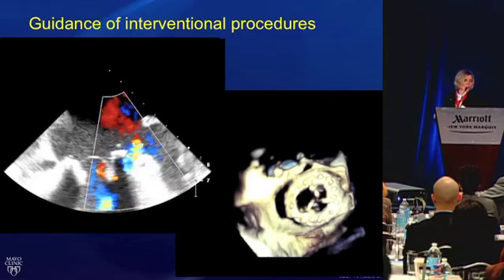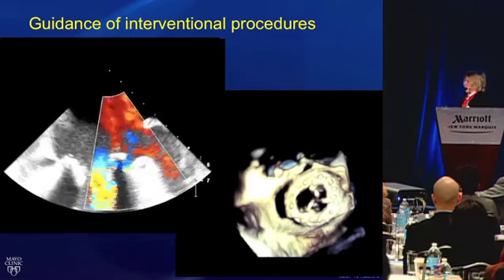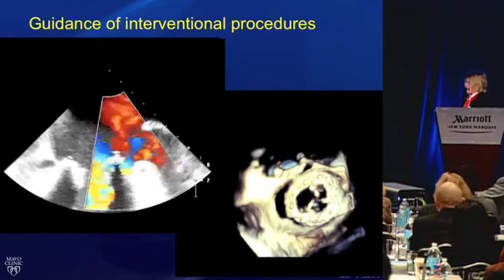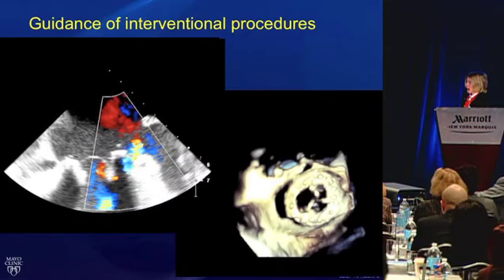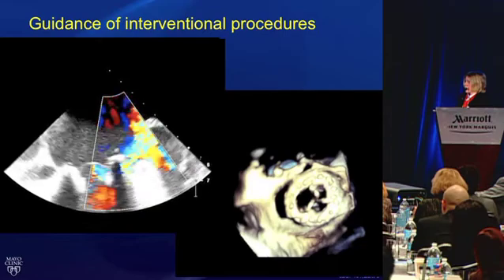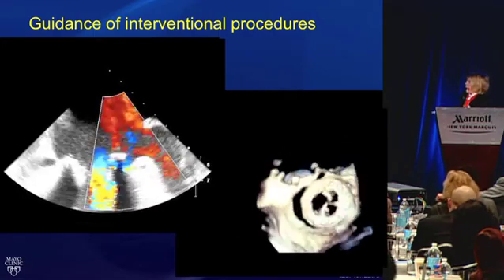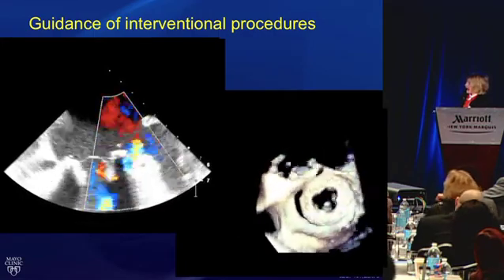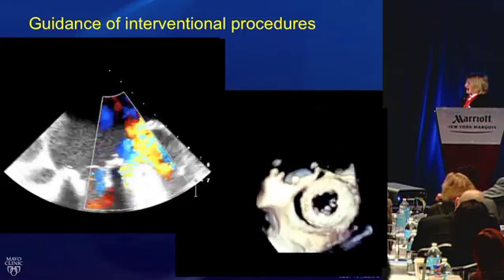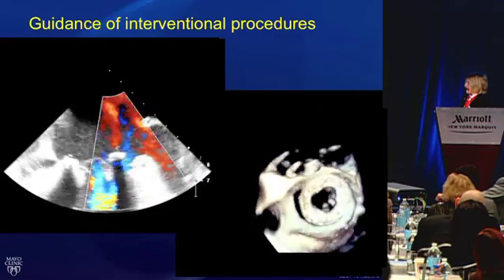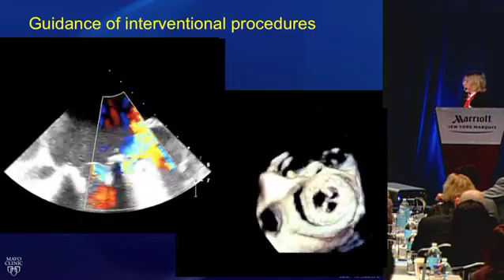Echocardiography is valuable for guiding interventional procedures. Here we can see periprosthetic mitral regurgitation in a patient referred for percutaneous closure of a paravalvular leak. But with three-dimensional echocardiography, we can see that this is not suitable for percutaneous closure with a device because there is a very large crescenteric defect.